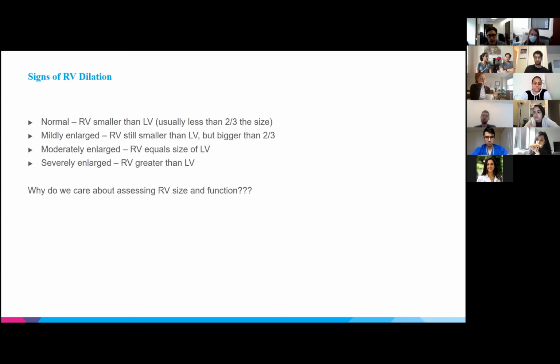So why do we care about assessing RV size and function? What might this be important for? Feel free to comment in the chat, and if you have any questions at any time, just let me know as well.